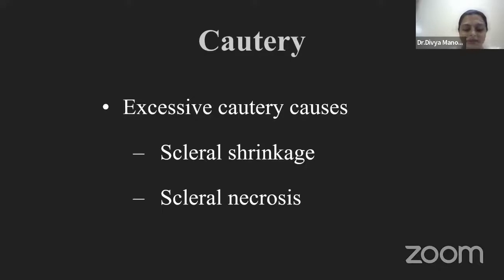Make sure you retract the subtenons area well. When there is charring of the subtenons, there is going to be irregular astigmatism caused by the wound. When you make a wound, ragged edges are going to be present, which is going to interfere with your outcomes. So that is very important.